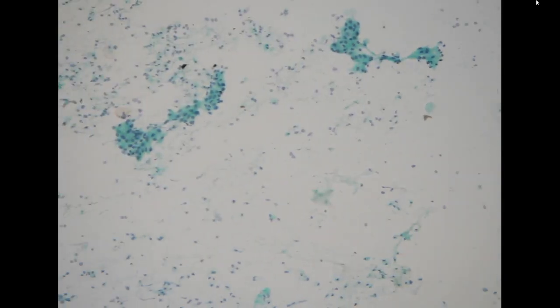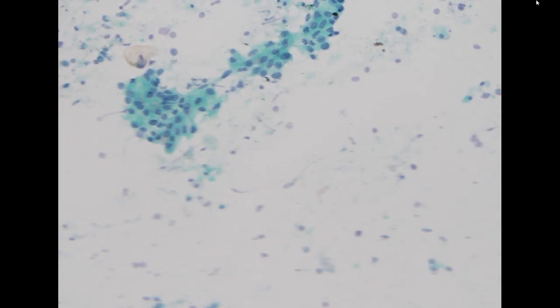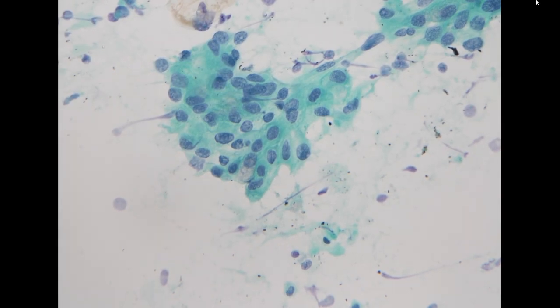So another case of pancreas adenocarcinoma. For this case, we didn't see a lot of benign looking cells in the background. Here we see a relatively uniform, not so polymorphic cellular fragment. However, we see very strange eosinophilic mucin in these cell clusters.